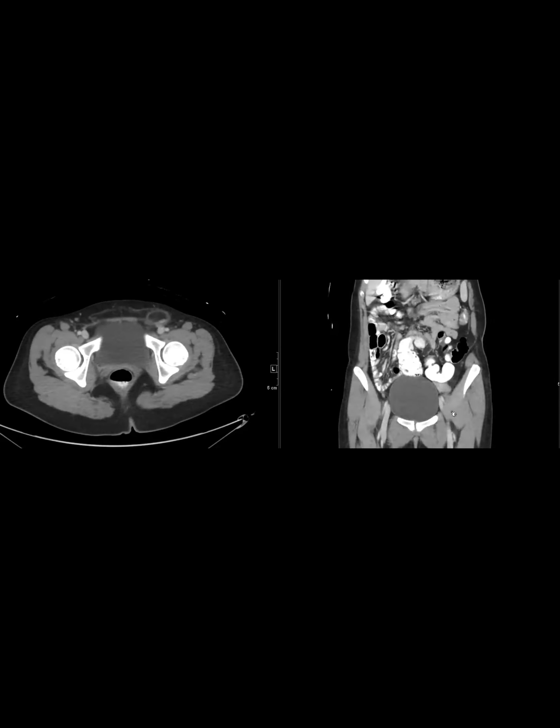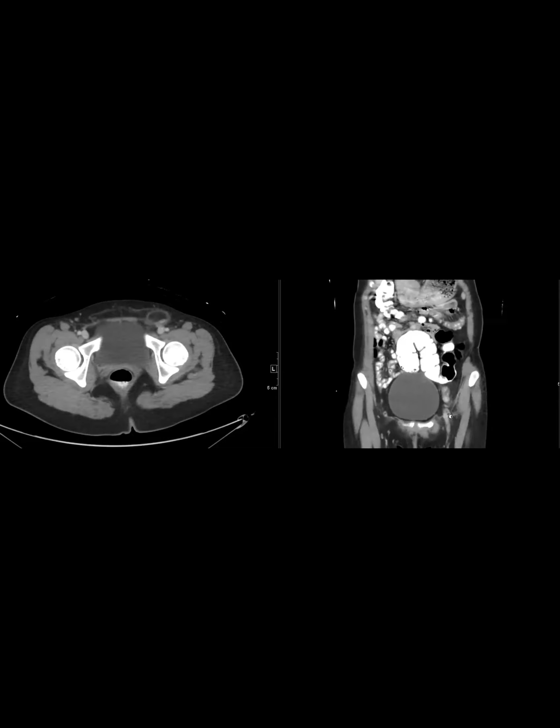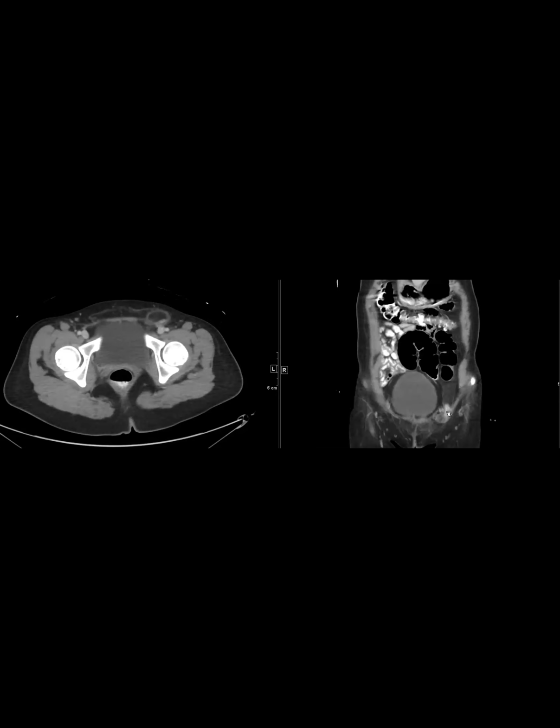She ended up having surgery. I've seen bladder protruding, obviously bowel, but I think this is the only time I've seen some adnexal stuff protruding into it.